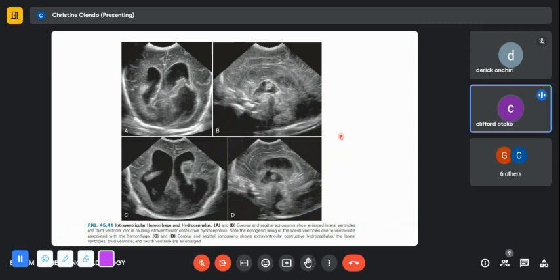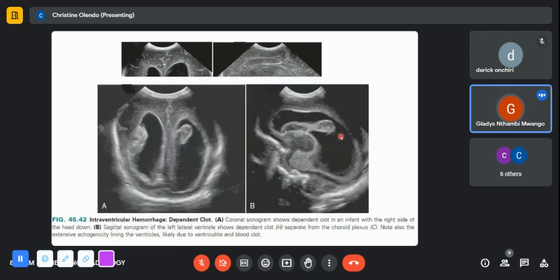It's really on imaging, when you do a neonatal ultrasound, when you have a choroid plexus papilloma and you have an intraventricular hemorrhage grade 3, I don't think it will be very easy to differentiate. A papilloma will be a mass, and it may or may not have hydrocephalus, but if there's hydrocephalus, it's going to be diffuse, extraventricular hydrocephalus, because it'll just be increased CSF, isn't it, right? Yes.